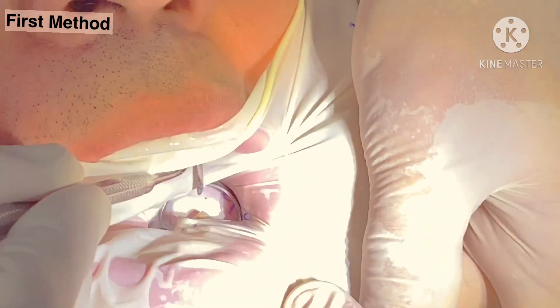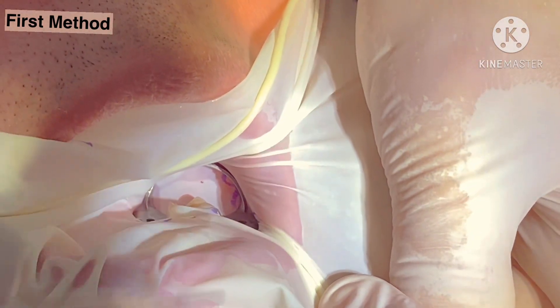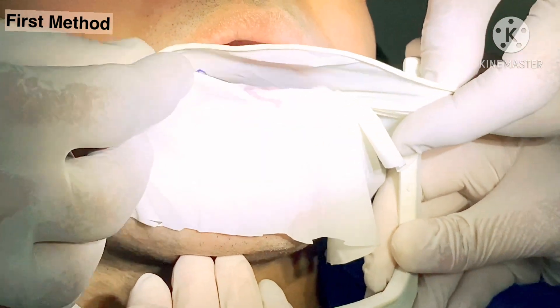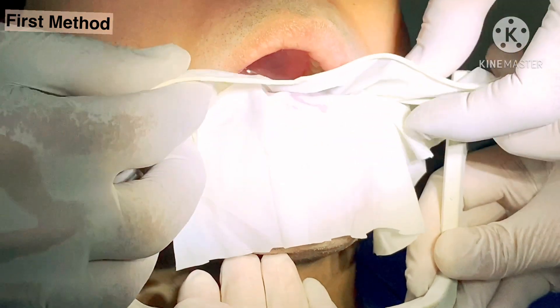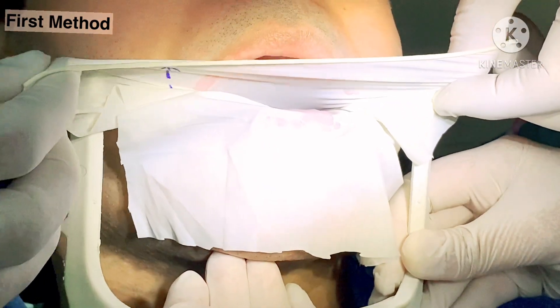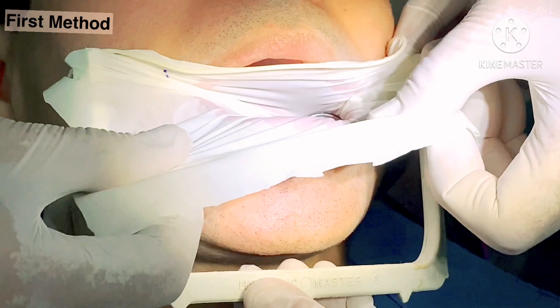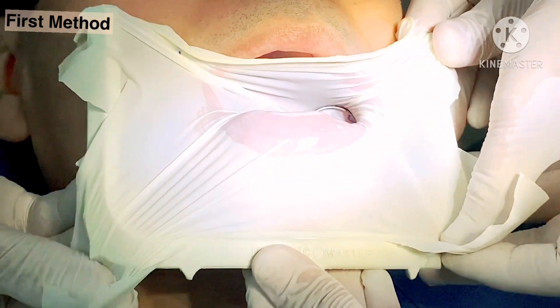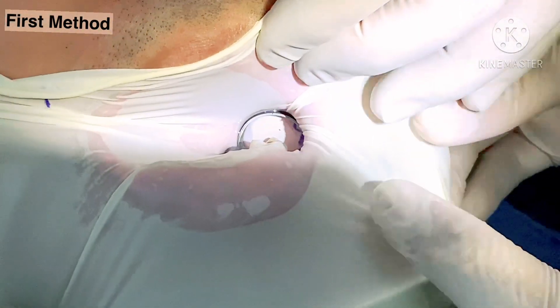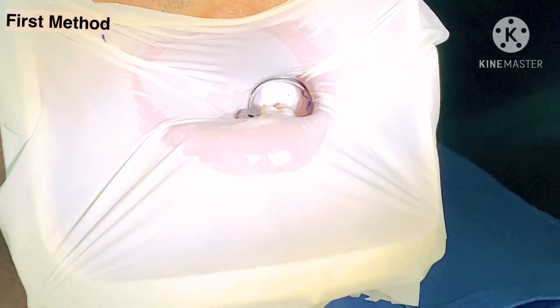Similarly on the buccal side. Now the rubber dam frame — it is put parallel to the upper lip. The rubber dam sheet coinciding with the upper portion of the hooks is bilaterally stretched and placed. Similarly for the lower, it is bilaterally stretched and placed. Please open. The whole field is exposed and we can work.